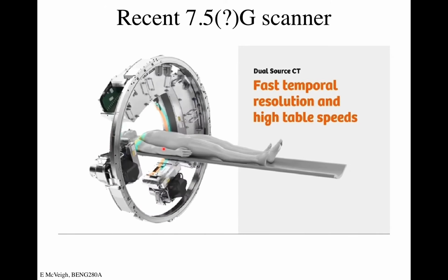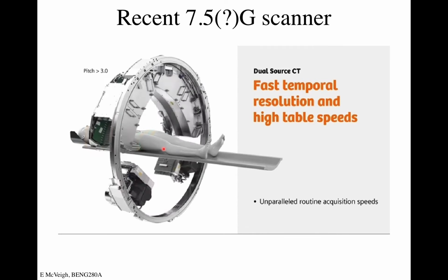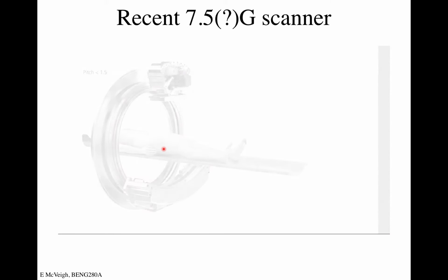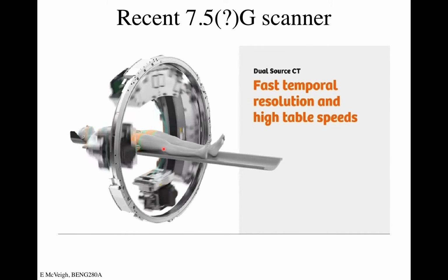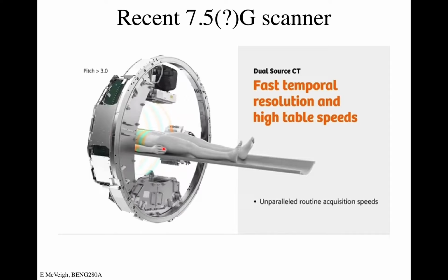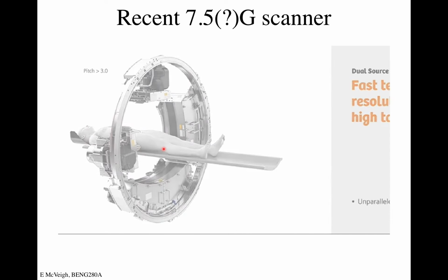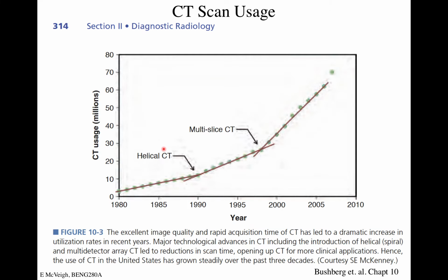And I really don't know about the acceleration. You'd think that when you're zooming through there, your organs would be accelerated, right? They claim, no, we have the ramp up, acceleration and velocity such that we hit our steady velocity when we're imaging, but I don't know about that. I would love to try, like, put a bowl of water on one of these tables or something, just image it going through and see, was it tilted up to one side? Anyway, this turbo flash mode is pretty impressive.